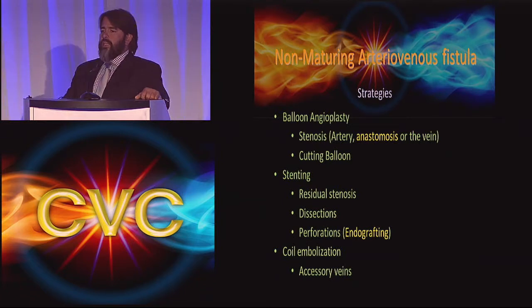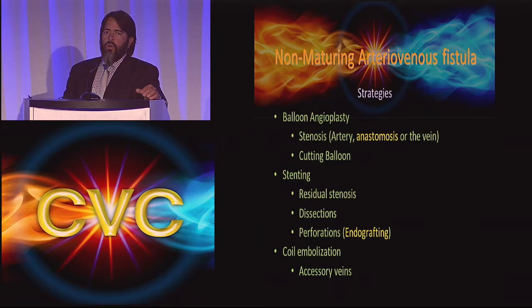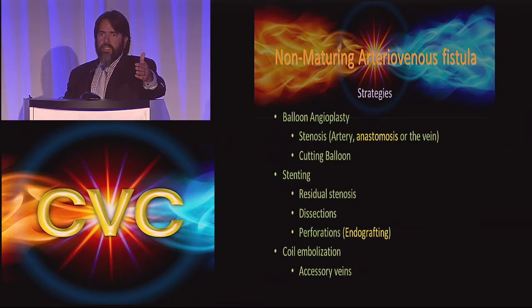So stenting, I leave it for times where I cannot get that vein to dilate, or when I get a dissection where I know that if I leave that dissection like that, the guy is going to come back thrombosed.